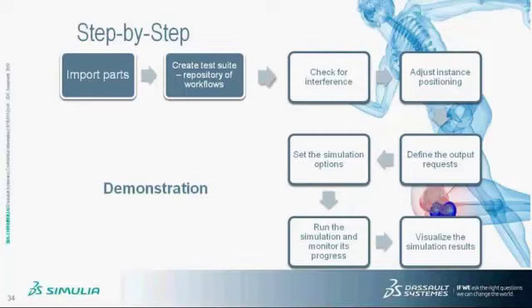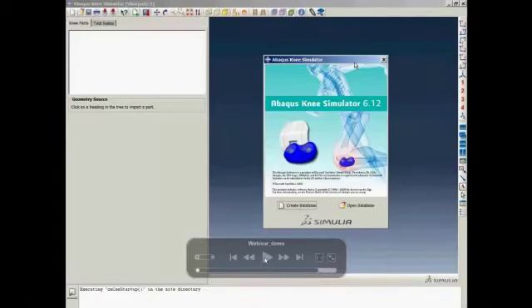So next is the demonstration of Abaqus Knee Simulator. We had issues running the live demonstration through WebEx. So instead of showing it live, we will be showing a video of the demonstration, and I will talk through the demonstration. Abaqus Knee Simulator always starts from the designer view, designer mode, and the user has the option to either create a new database or open an existing database. In this case, because I need to show the visualization of the analysis results, I chose to open an existing database.